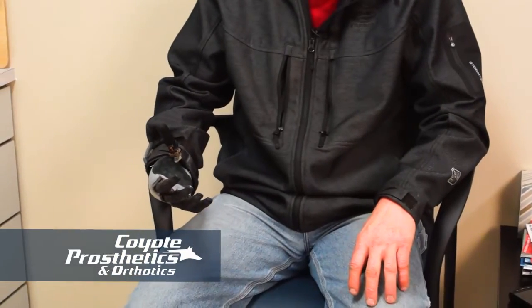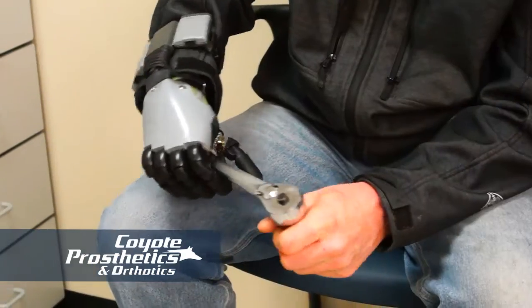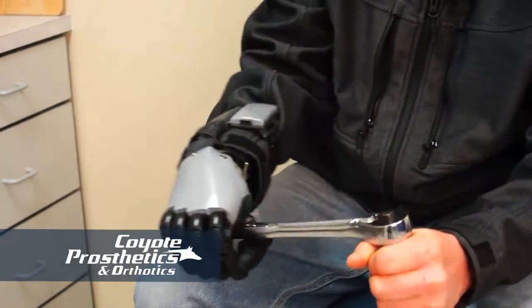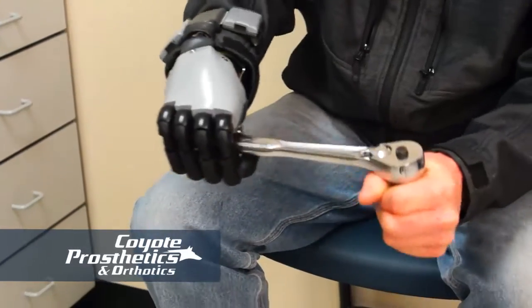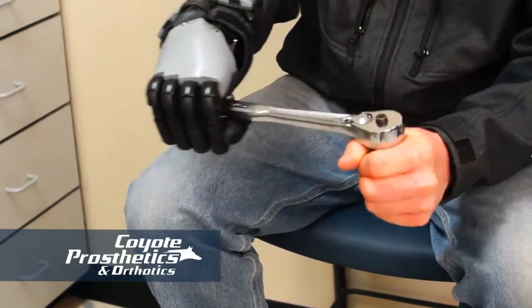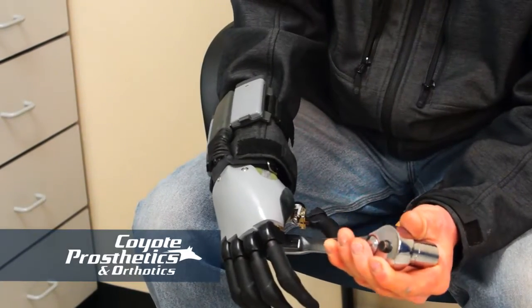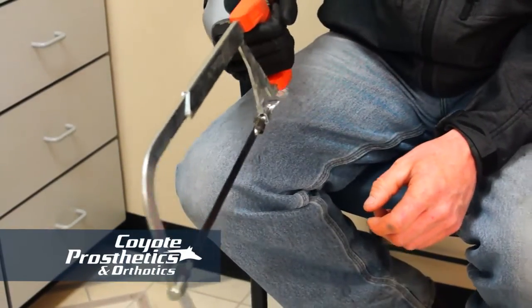I'm still getting used to the new hand. I love it. It just puts me closer to being 100% again. I'm still learning the capabilities of it, learning what it can benefit me doing. I don't have feelings still, so I still have to keep a close eye on where I'm grabbing with it — doorknobs, things like that — but I'm getting more familiar with it all the time.